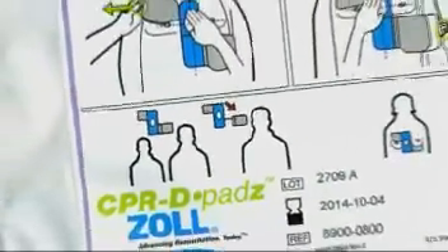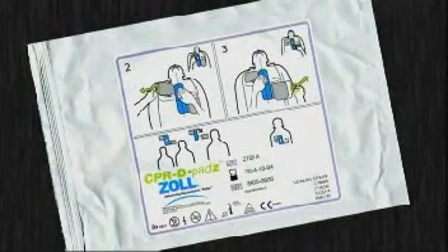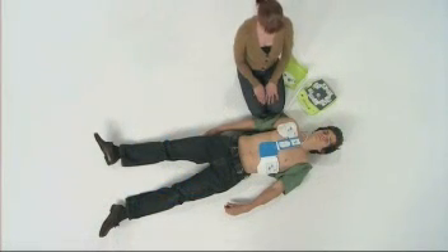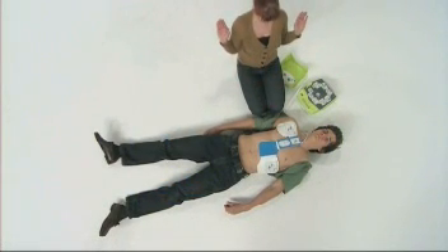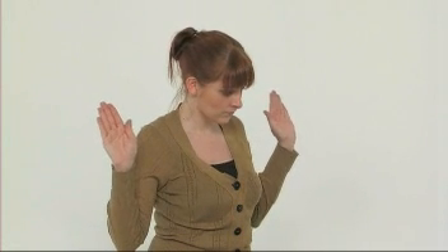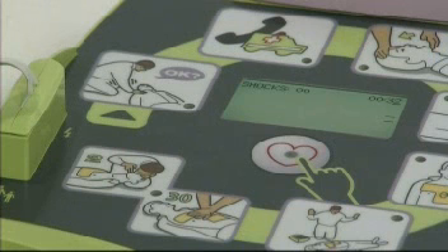Instructions on the electrode pack remind you how to attach the electrodes to the patient. Once the pads are applied, the AED Plus will automatically analyse the patient. You should not touch the patient at this point, and the AED Plus will remind you of this.